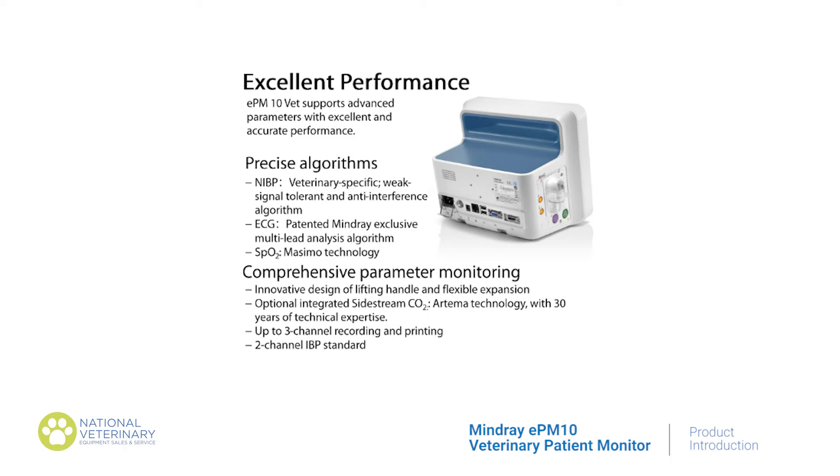The EPM10 supports advanced parameters with excellent and accurate performance. It uses precise algorithms for SpO2, invasive blood pressure, and ECG. This ensures accurate blood pressure measurement even if the signal is weak, and the ECG reading is unaffected by interference.